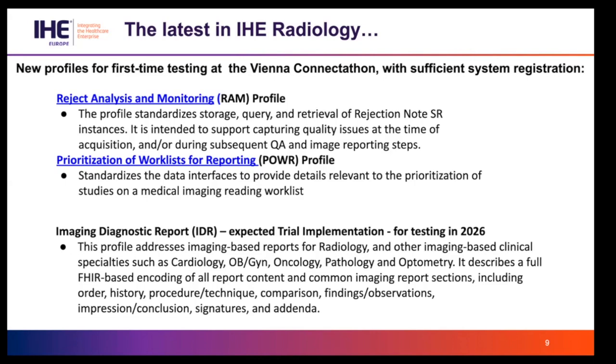Another profile is imaging diagnostic report, which has been developed primarily in the last cycle, and we expect it to be approved for trial implementation fairly soon. It's not going to be tested in this Connectathon, but most possibly in the following year.